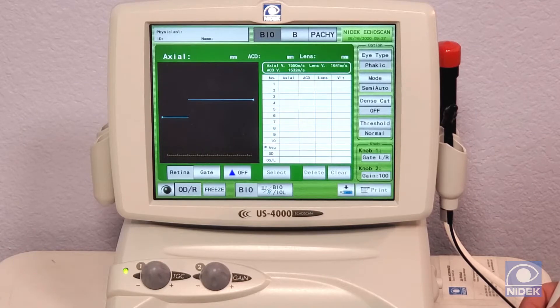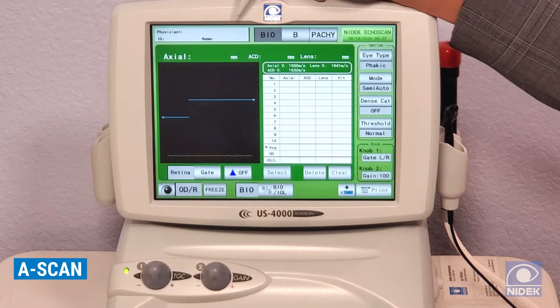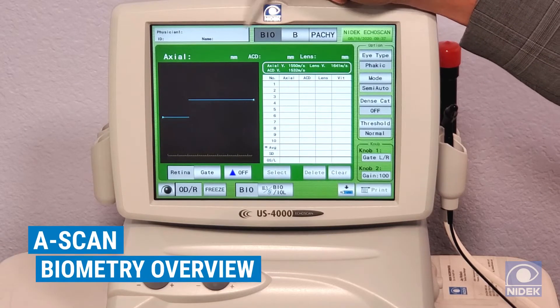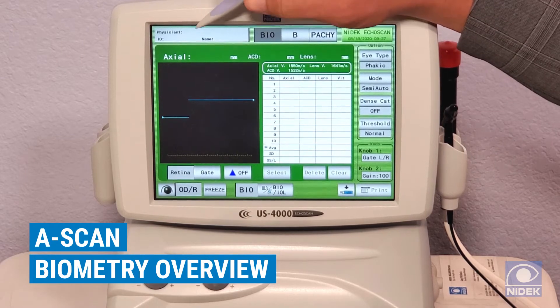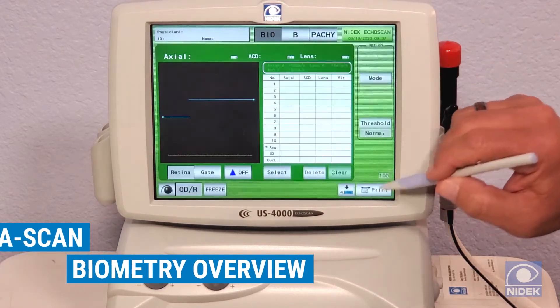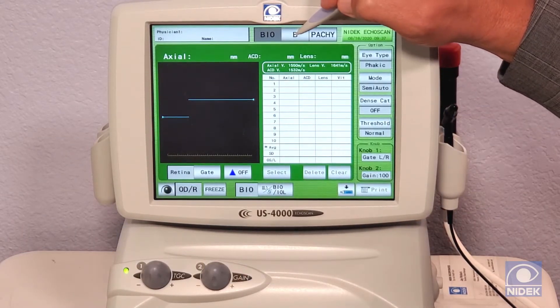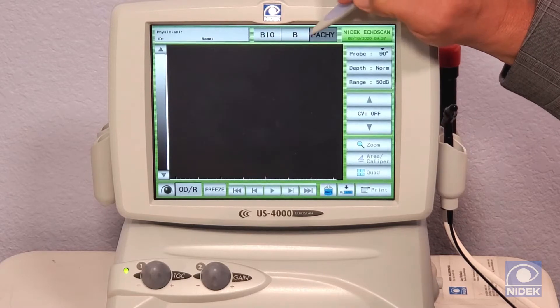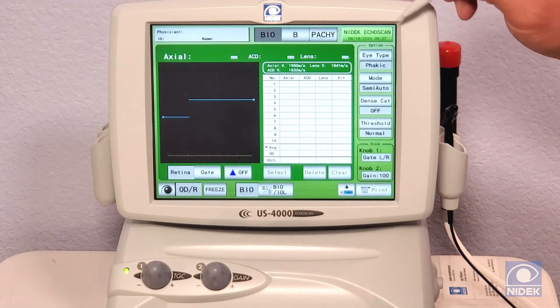My first demonstration on the US-4000 will be A-scan biometry. So we're in the A-scan biometry screen. This is where you enter your patient demographics. The tabs here are biometry, B-scan, and pachymetry. We'll stay in biometry for now.